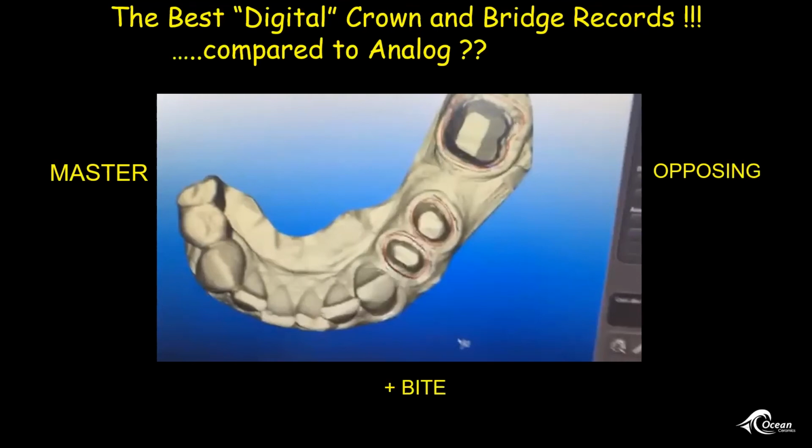You don't even have to wait 5 minutes for the material to set. It takes less time than that. And those models that I took for you for that study, probably 20 minutes. Oh, okay. That would have been it.